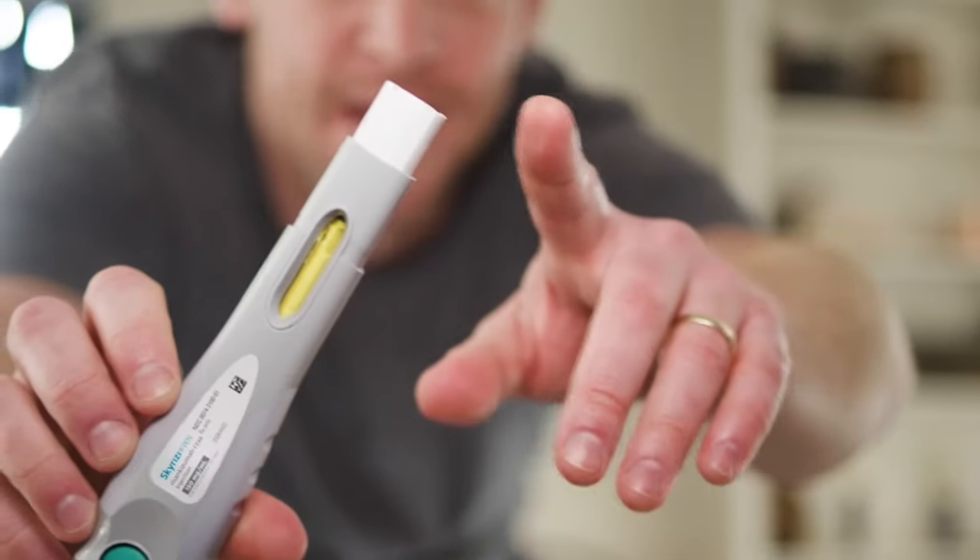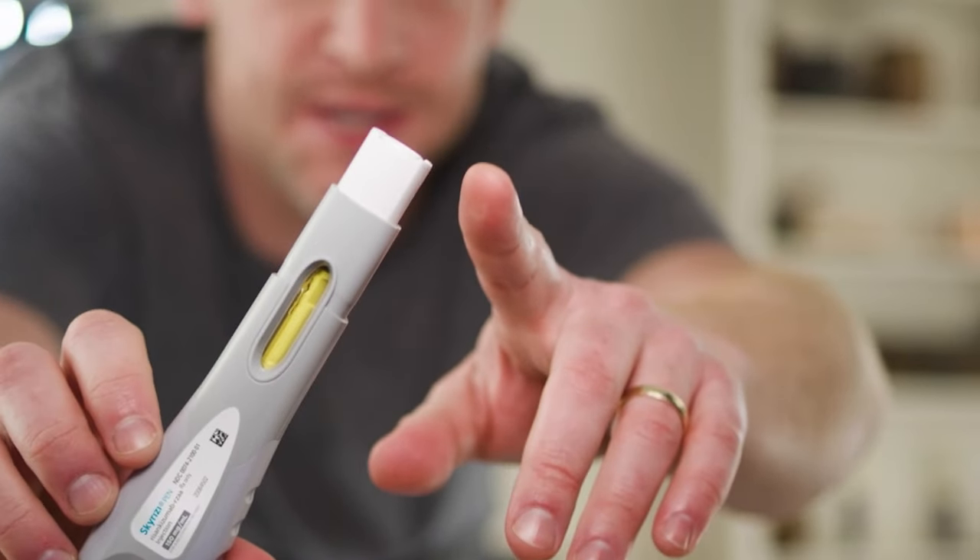You might notice one last click. You see how the white needle sleeve covers the needle tip?